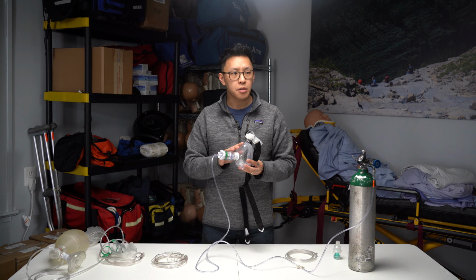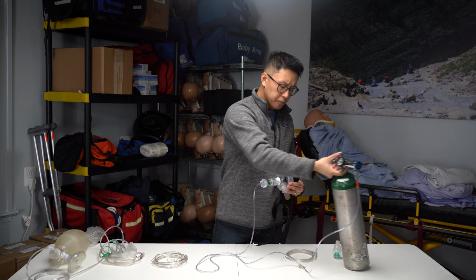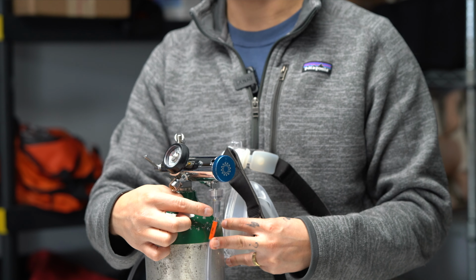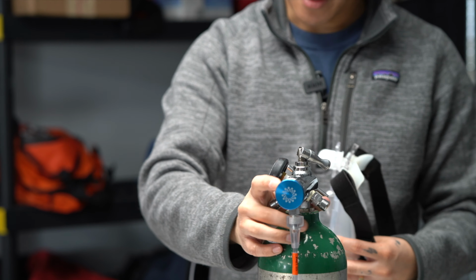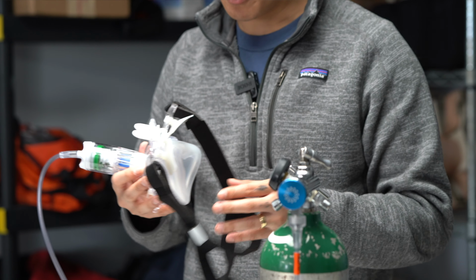Become very familiar with the CPAP that your employer or department uses. Ours, simply put, at the distal end of our oxygen tubing is going to be an orange tab that reminds us to apply 10 liters per minute of oxygen. And then the only thing we need to adjust is the level of PEEP, okay?